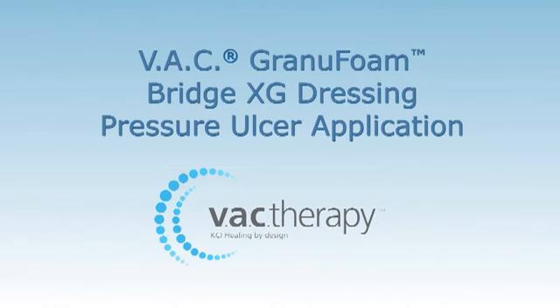V.A.C GranuFoam Bridge XG Dressing, Pressure Ulcer Application.